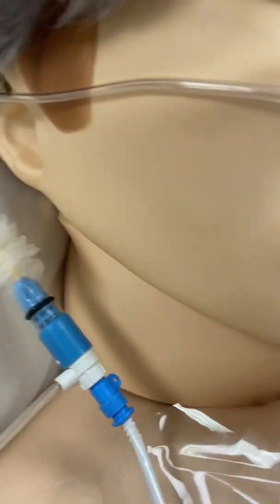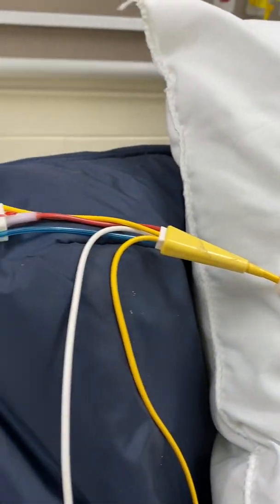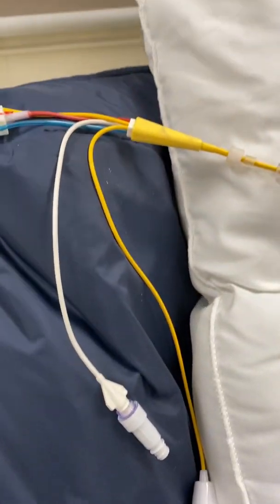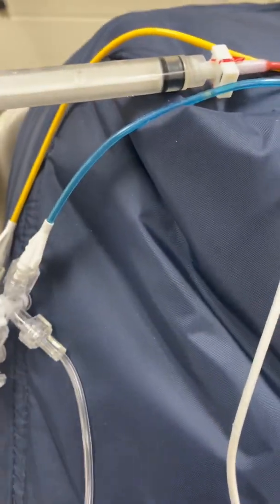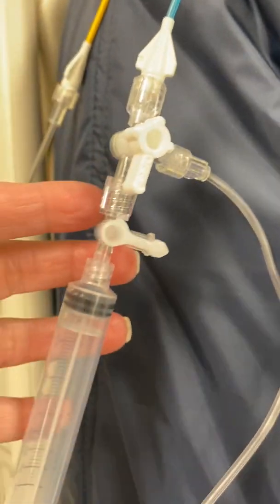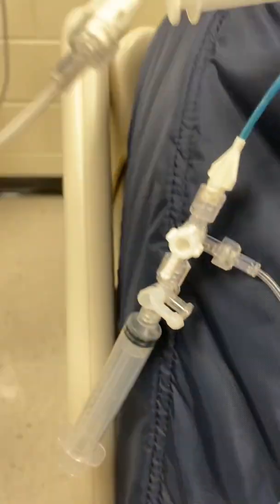And then this catheter just infuses through that port. Now let's follow it up, and you can see all the different ports. A lot of these go to things that would allow monitoring. This is connected to our transducer. There's infusion ports. And then this is the tubing.